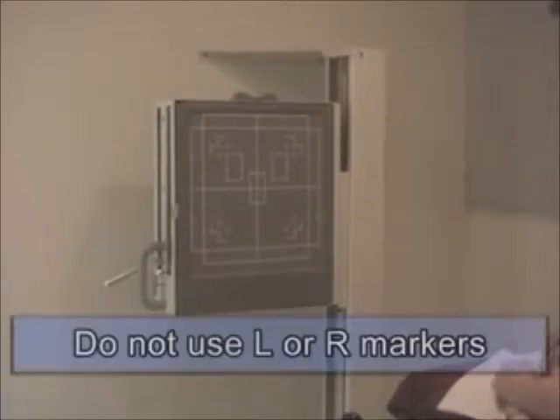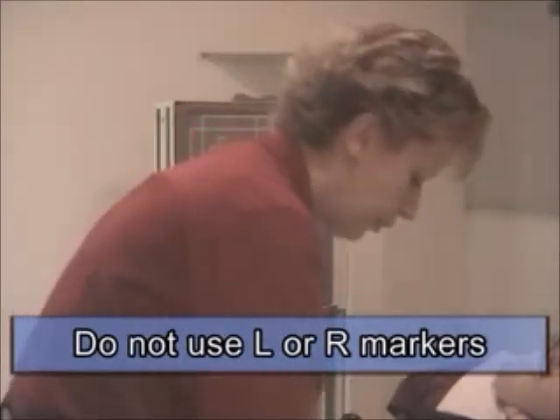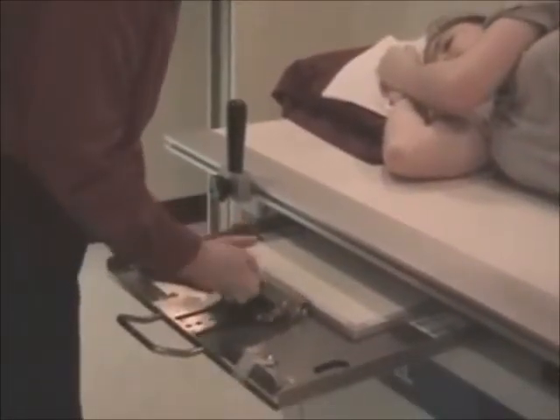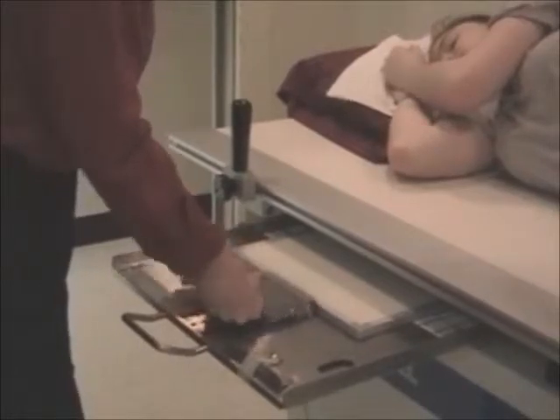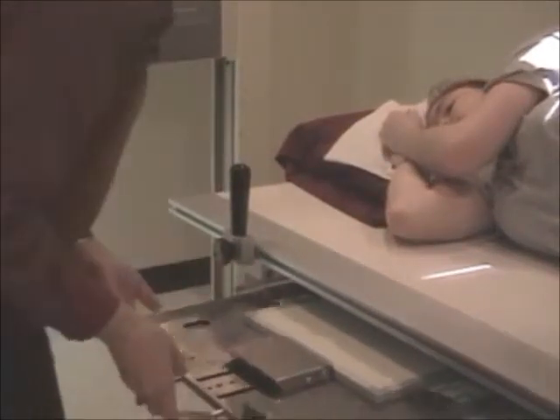And we will not use an L or an R marker. We will just use tech initials. I'm placing the cassette lengthwise in the Bucky tray for a right lateral, and the ID is to the top. Collimate to your 10x12 lengthwise.